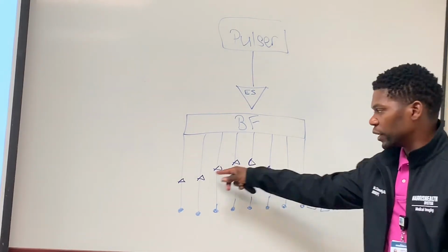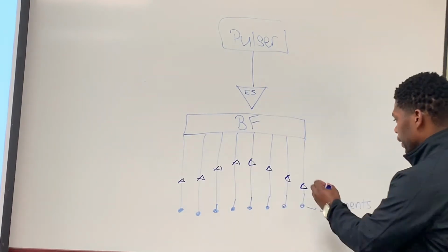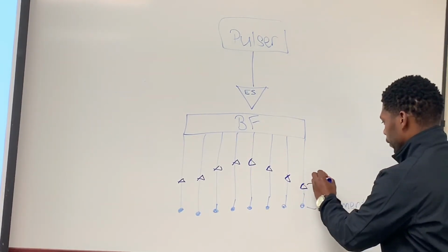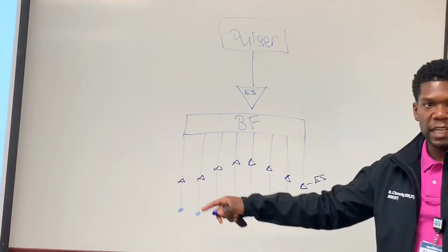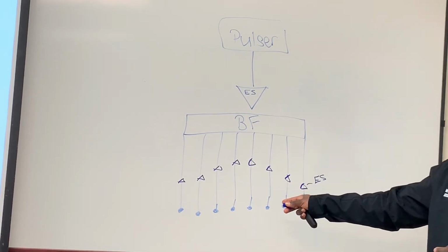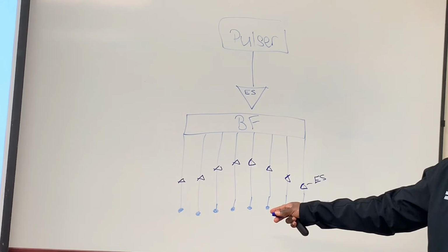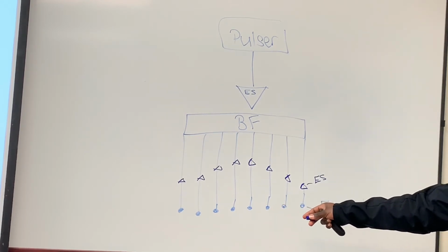So I drew this right here. These are my electrical signals, my ES created from the beamformer. Okay, so I drew this on an actual slope. So the time it sends those signals out is actually going to focus this beam, because I have it in the slope, right? So it's going to cause those signals to be focused now.